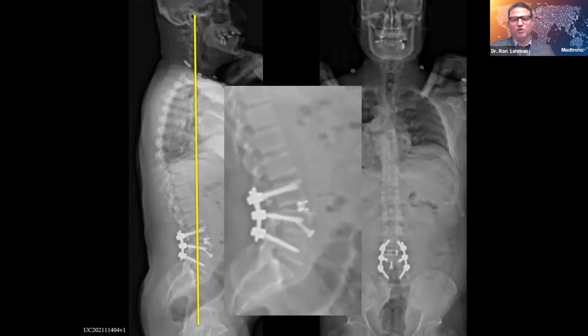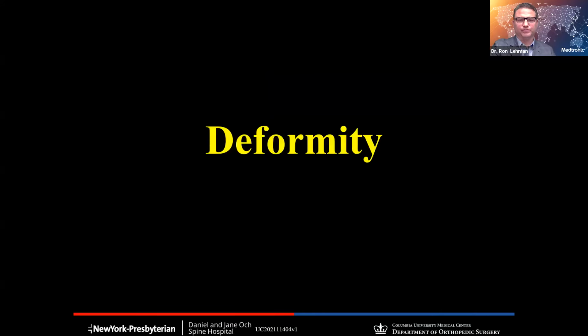We make sure that we palpate with a Woodson to ensure that we don't have any neural compression, especially when we really try hard to get lordosis at 1 and 2 levels through the interbody space, obviously, because we can close down that foramen. So it's important to make sure that you palpate the foramen before you stop to make sure you don't have any postoperative radiculopathy.